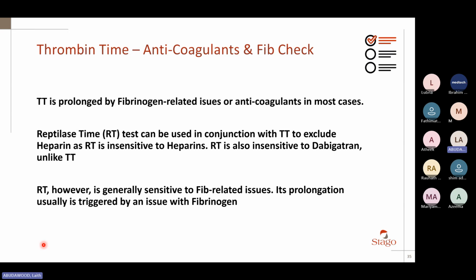If both are prolonged, thrombin time is prolonged, reptilase time is prolonged, then it is very likely to be a problem with fibrinogen or the presence of fibrin and fibrinogen degradation products in the patient blood. Is this point clear? Should I repeat it? Clear. Very good. Okay.